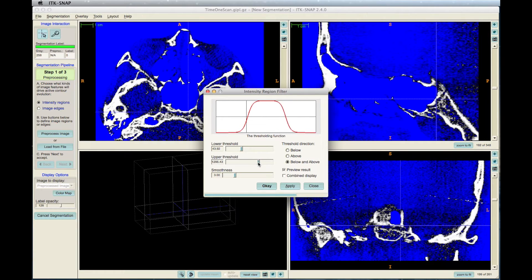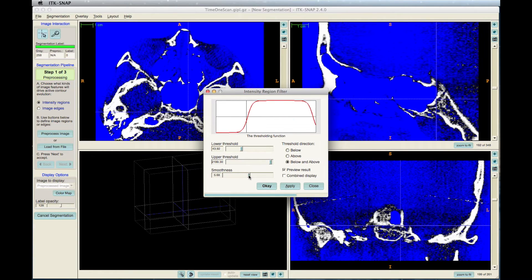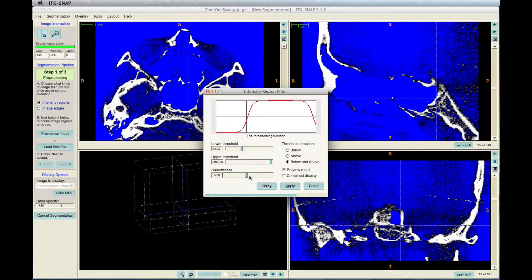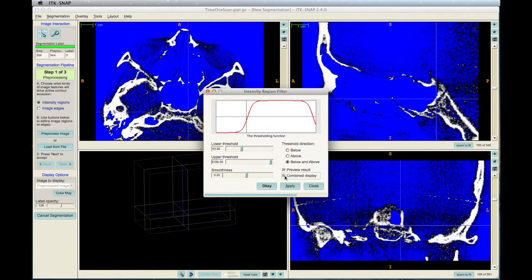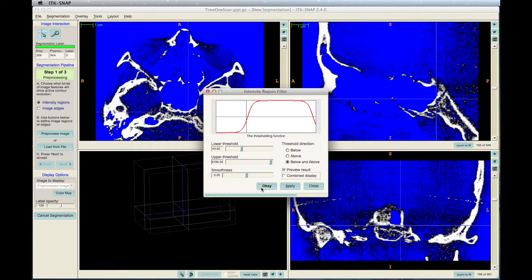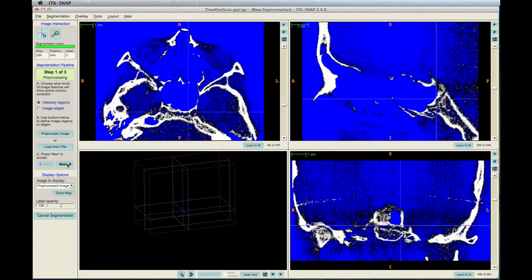Try to minimize noise. You can check the Combine Display option if you wish. When finished, click OK in the window, then Next in the toolbar on the left.